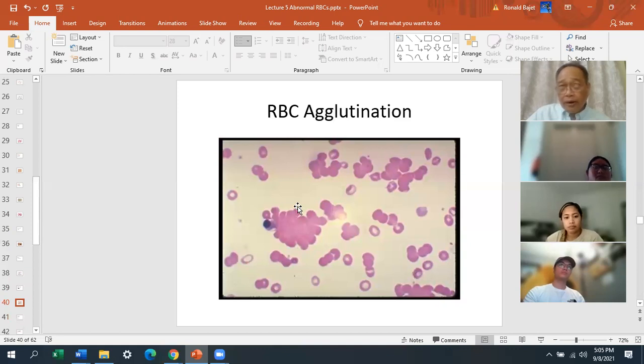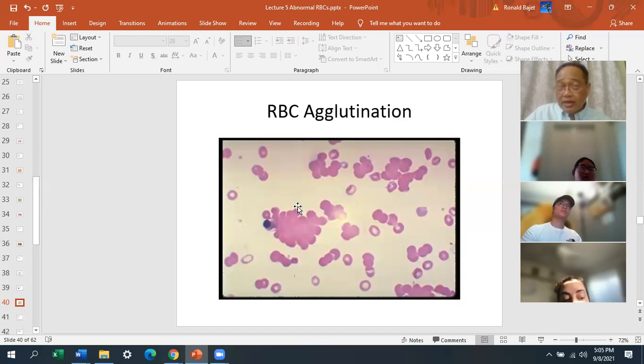The correction for Rouleaux formation is doing what? Saline replacement, because of the high protein. What is the correction for lipemia? Saline replacement. Or icterus, a person with a liver problem? Same thing, saline replacement.